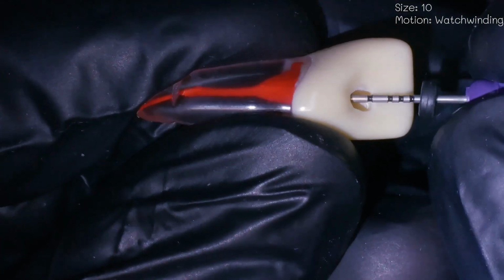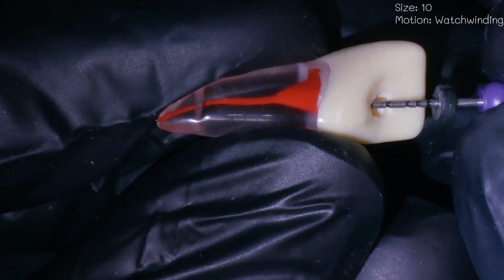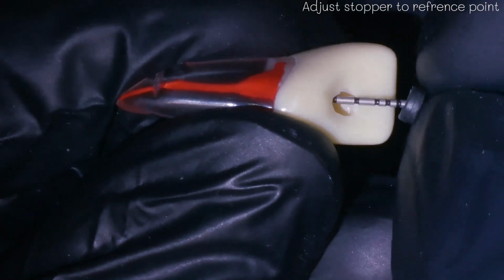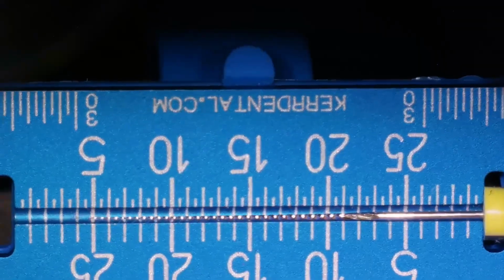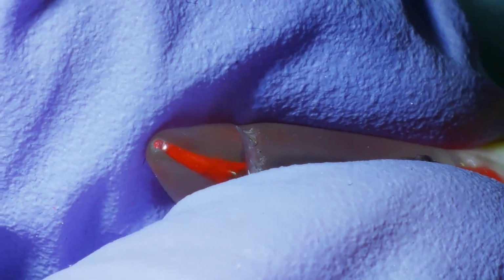For this preclinical exercise, working length is determined by pushing the file beyond the apex and then twisting it back inside the canal. Then, the rubber stopper is adjusted to the reference point. It is 25 millimeters for this particular tooth. In a real clinical situation, the working length is determined by the apex locator and confirmed by a radiograph. Accuracy is essential in this step to avoid over-instrumentation.